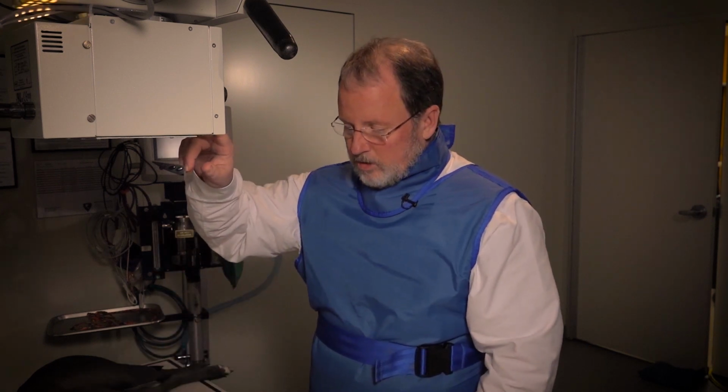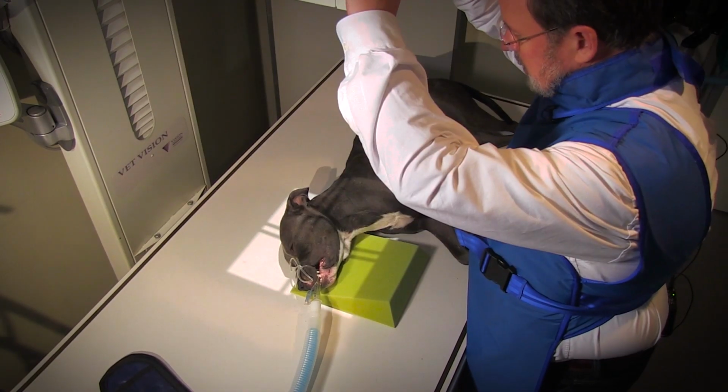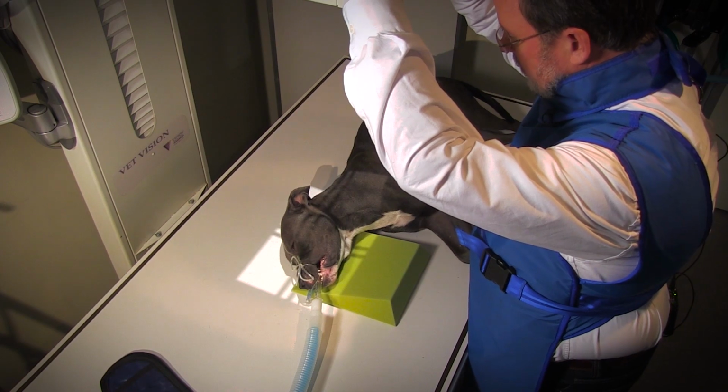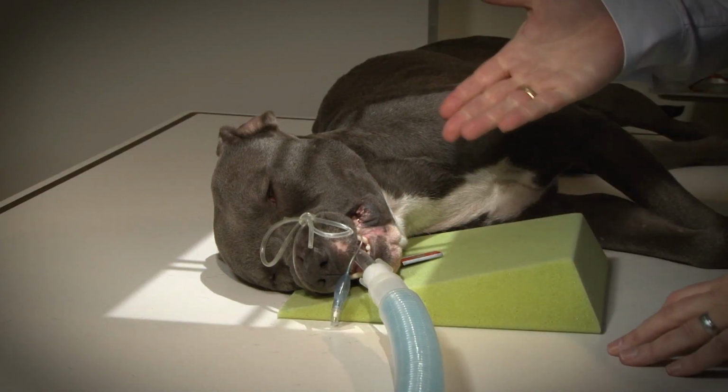The next thing is we're going to turn our collimator light on, and we want to collimate down to the size of the skull and center over the skull. And so we're going to collimate right down to where we get the entire skull, but really nothing else. And then we're going to put our right marker on here because he's in right lateral view.